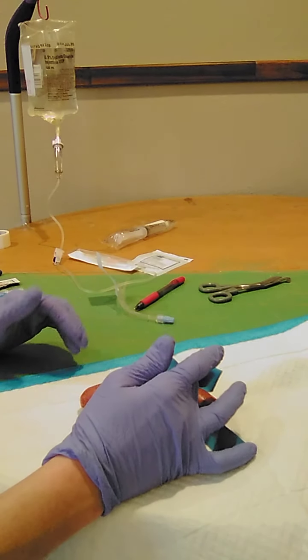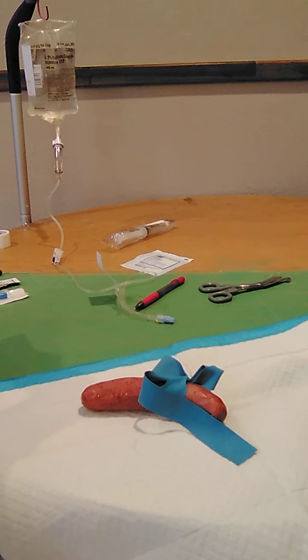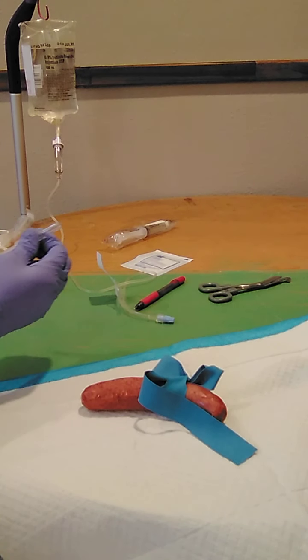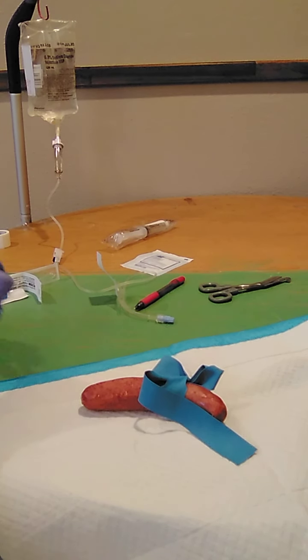So I see that that is dried well now. And remove this, maintaining its cleanliness and its sterility. Okay.